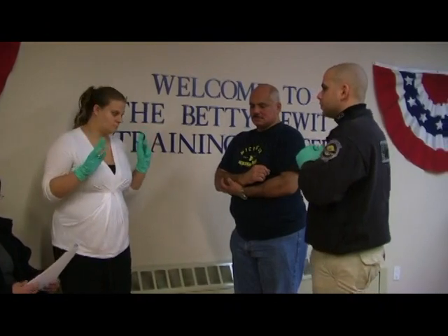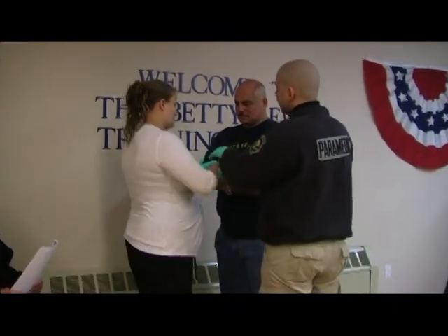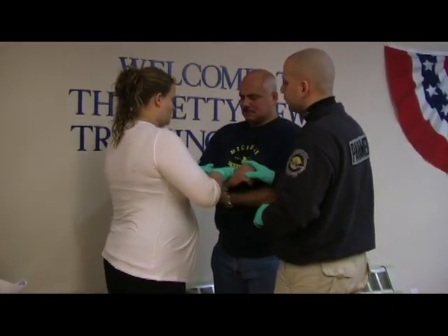BSI. I'm going to have my partner come in, and I direct my partner to take manual stabilization of the injured arm.